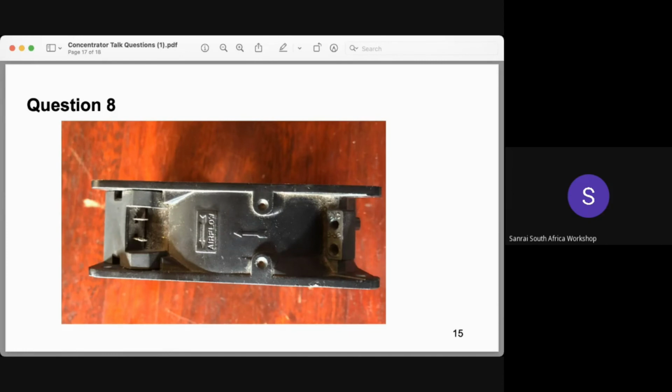To fix a faulty fan problem, one needs to replace it with a new one. When replacing the fan, take note of the AC or the DC voltage and the power rating. Interchanging these can end up damaging the fan even though it is brand new. Apart from the voltage and the power ratings, also take note of the orientation of the fan by checking the two arrows that are placed on the fan. One indicates the direction of the rotation of the blades and the other indicates the direction of airflow. The placement of the fan in the concentrator affects whether it blows cold air into the concentrator from the external surrounding or sucks out hot air from the concentrator to the external surrounding.